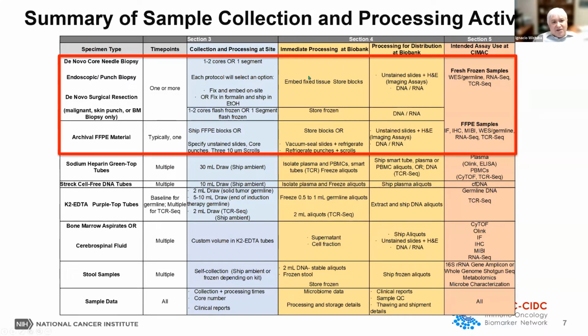For the sample that we want to collect for the study from the tumor, if there are core biopsies, for example, we ask for at least 2 cores, preferably 4, or for endoscopy biopsies. When you have surgical resection, you have more tissue available. It's important that this tissue, if it's fixed in formalin, is for no longer than 24 hours. If not, it needs to be transferred to another liquid like ethanol for transportation to a biorepository for final processing and to make a paraffin block.